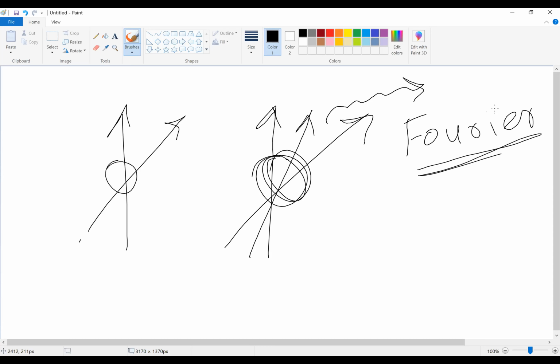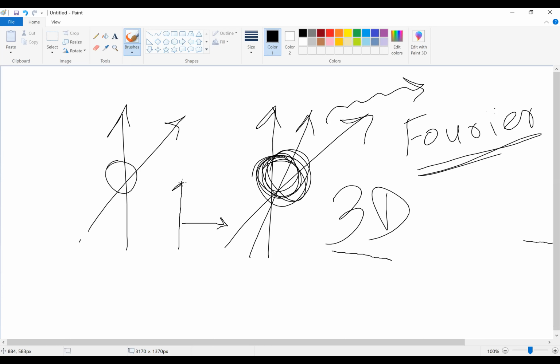He explained how we can change different waves into equivalent voxels or pixels. These are the words we use. So voxel is used for a 3-dimensional image in the case of MRI. Now this, going back to this same direction, happens in 3D, right? So one change happens in the x-axis, and one change happens in the z-axis, and we have different times for these, and these different times are called T1 and T2.